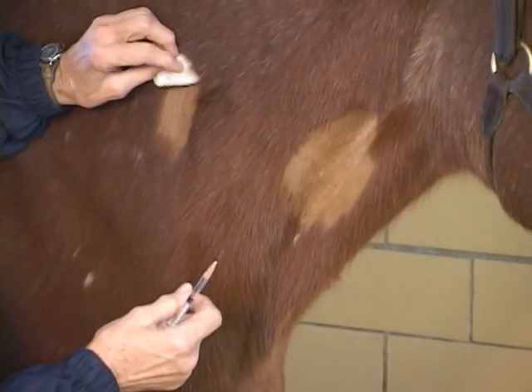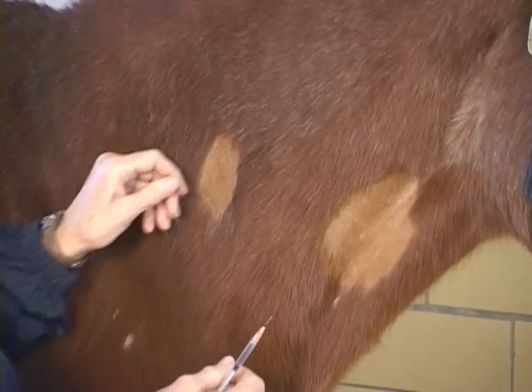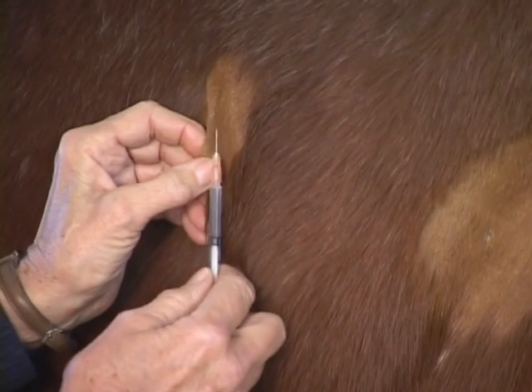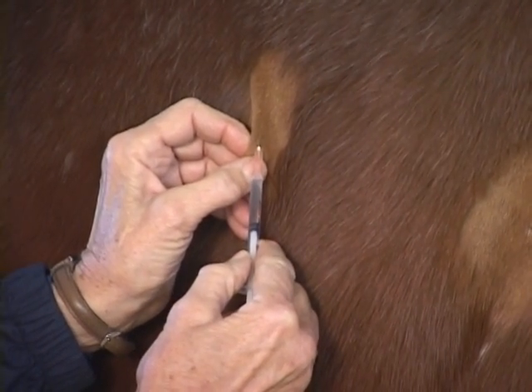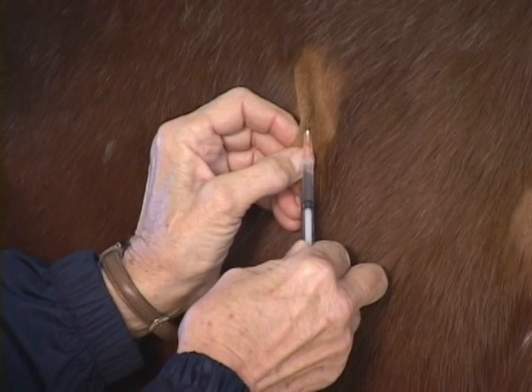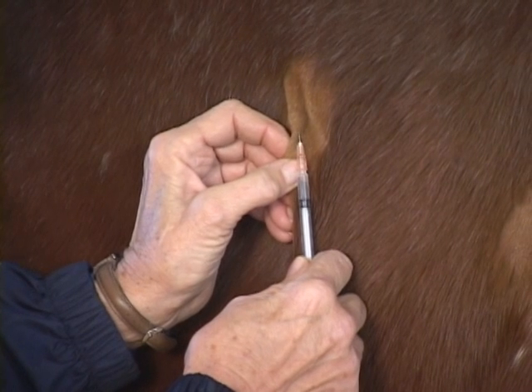Wintertime here with this heavy coat, it would be pretty mandatory to have to clip that so you can see where the skin is. You're going to tent the skin up, and I want to see — I'm using a very shallow angle here. I just want to get into the layers of the skin, and as I give that, I don't know if you're going to be able to see it on camera, but there's a bleb that's arising in the skin itself.